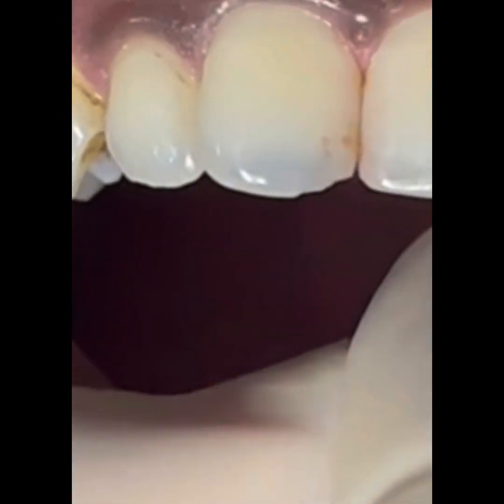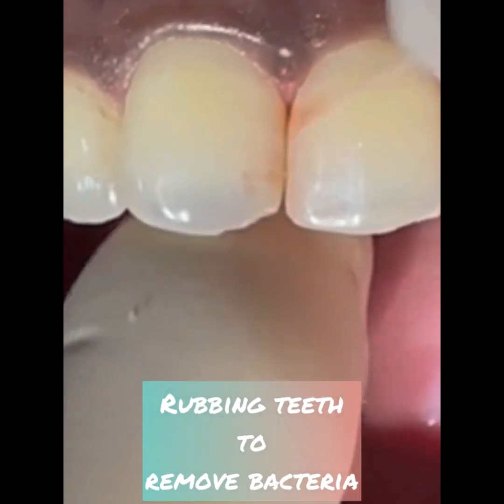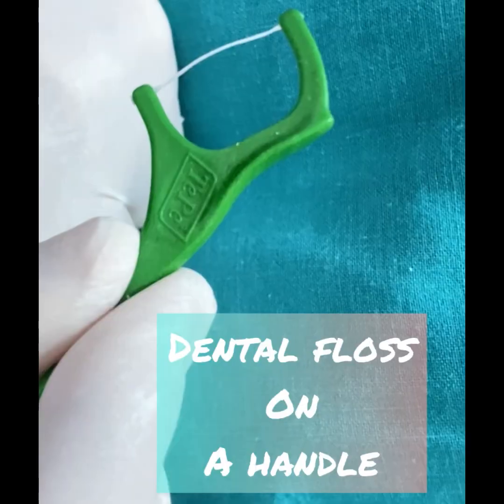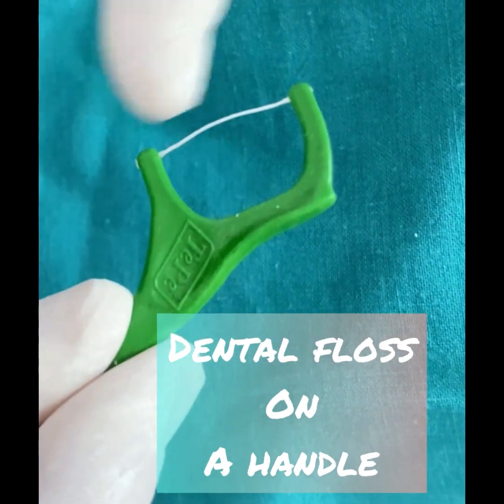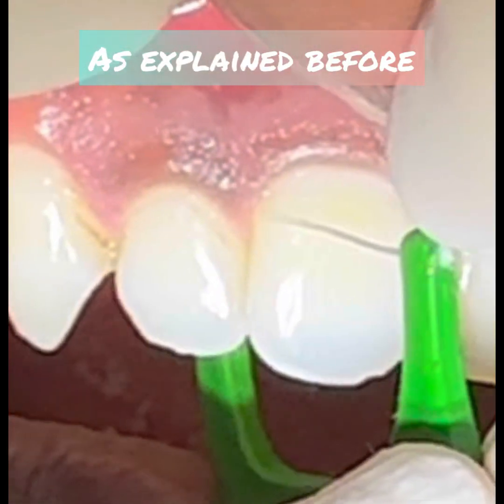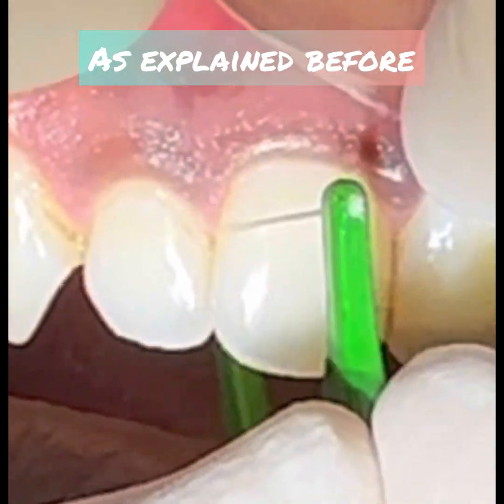We floss to remove the bacteria, and the bacteria can be removed only if you stretch and bring it, rubbing it from up to down in the upper teeth and reverse for the lower teeth. Floss is also available stretched on a small handle for easy maneuverability. Now the floss is taken below the gingival sulcus, and then it is stretched and rubbed up and down to take out the material.